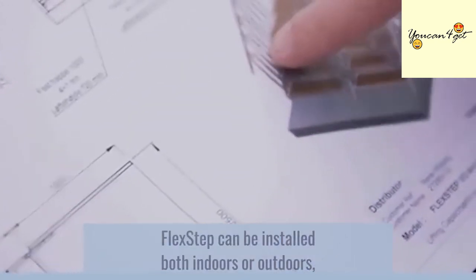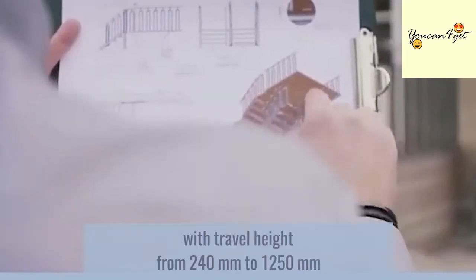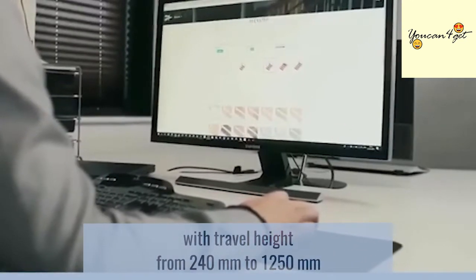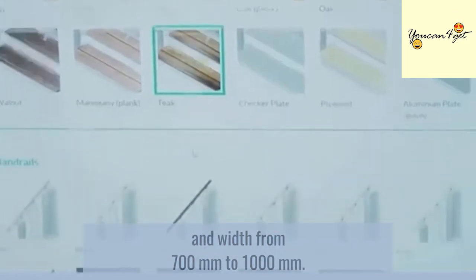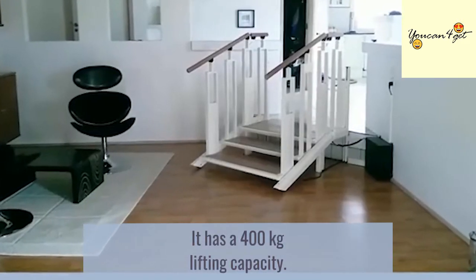FlexStep can be installed both indoors or outdoors, with travel height from 240 mm to 1250 mm and width from 700 mm to 1000 mm. It has a 400 kg lifting capacity.